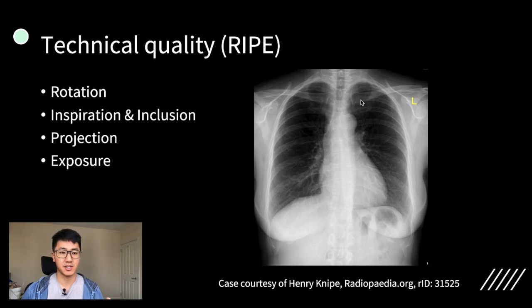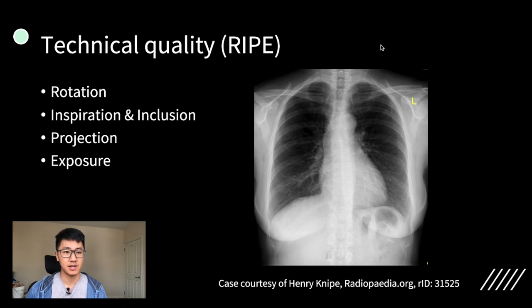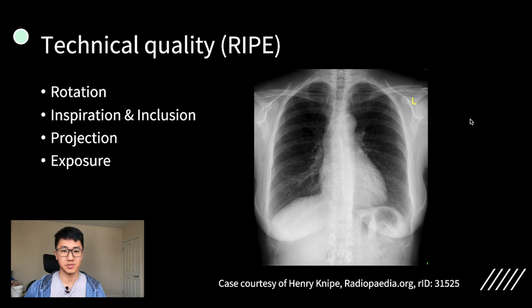For rotation, you're looking at whether the patient is rotated. To assess that, you make sure the spinous processes of the vertebral column are in between the heads of the clavicles. This is important because if a patient is rotated, you might think that their mediastinum is deviated when it actually isn't.